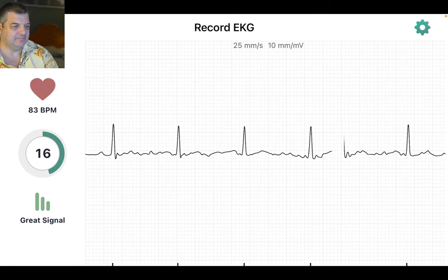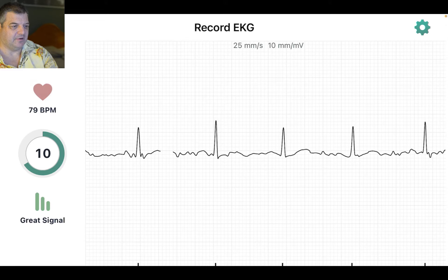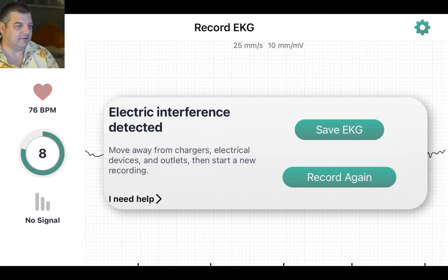It's pretty cool. I'll try to stay still, because apparently if you move too much it affects it. Still got 8 seconds to go. Processing... Electrical interference detected. It's probably too close to my microphone.